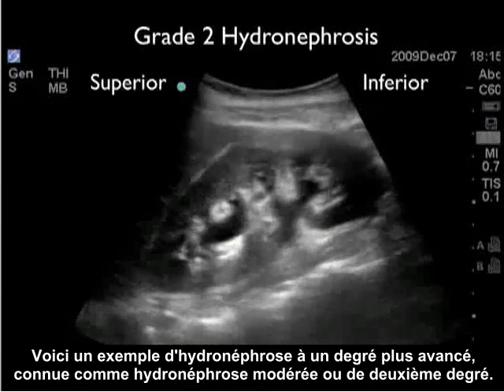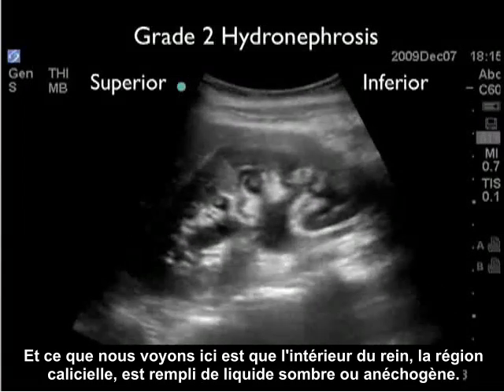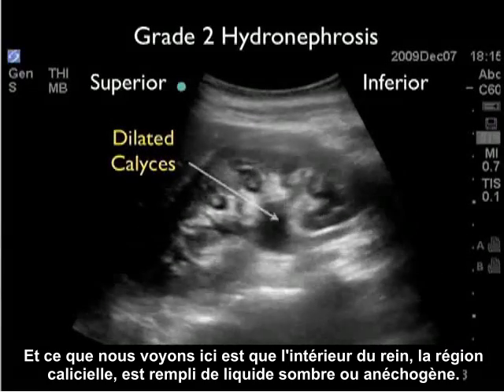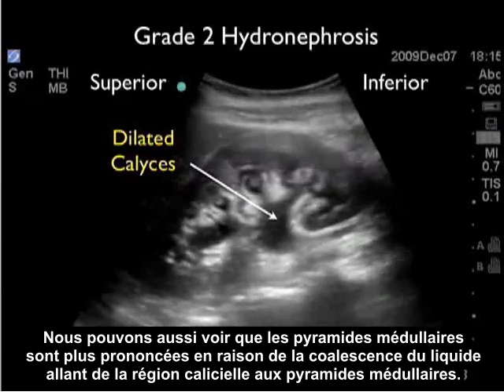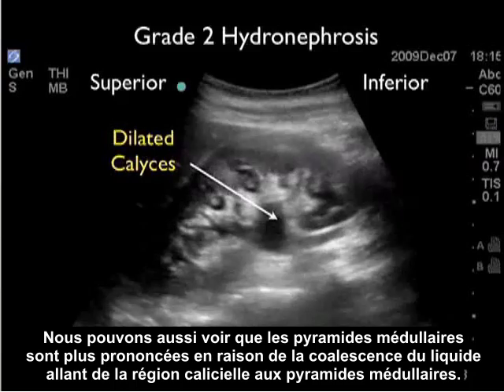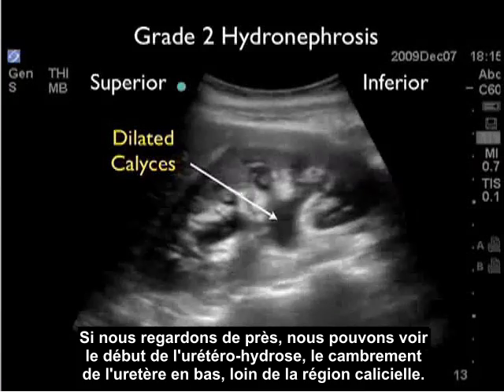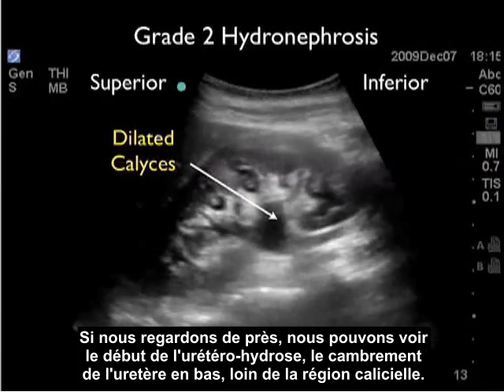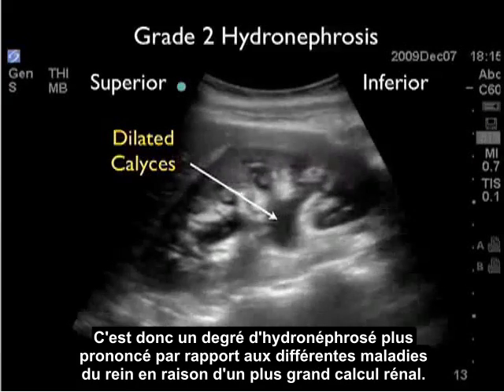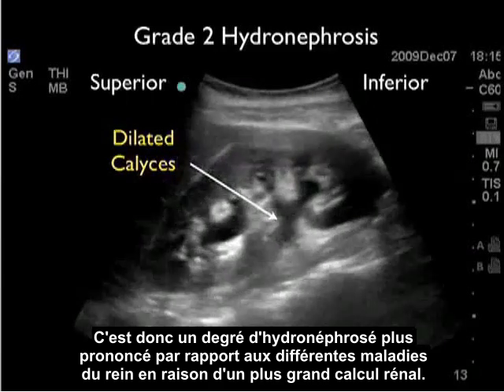Here's an example of a more advanced degree of hydronephrosis known as moderate or grade two hydronephrosis. What we see here is that the interior of the kidney, the calyceal region, is filled with dark or anechoic fluid. We can also see that the medullary pyramids are more pronounced due to the coalescence of fluid going up from the calyceal region into the medullary pyramids. And if we look closely, we can see the beginning of hydroureter, the arching away of the ureter coming down inferiorly away from the calyceal region — a more pronounced degree of hydronephrosis due to a larger kidney stone.